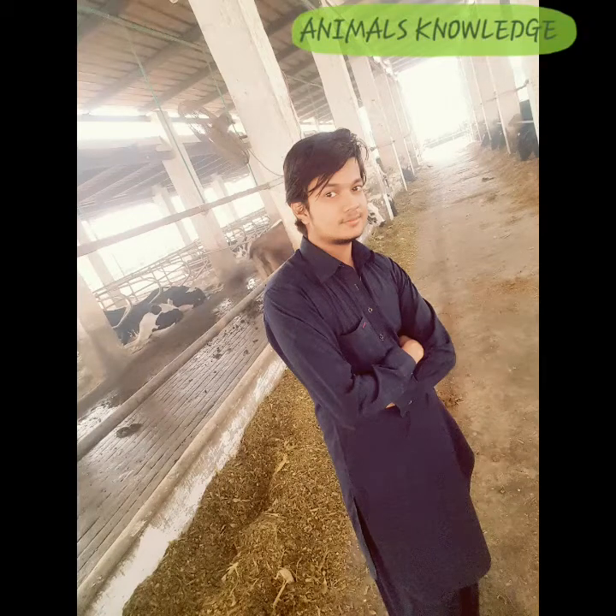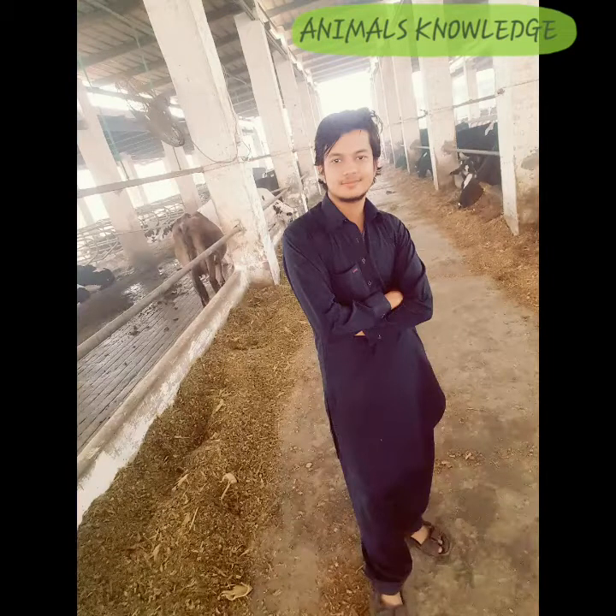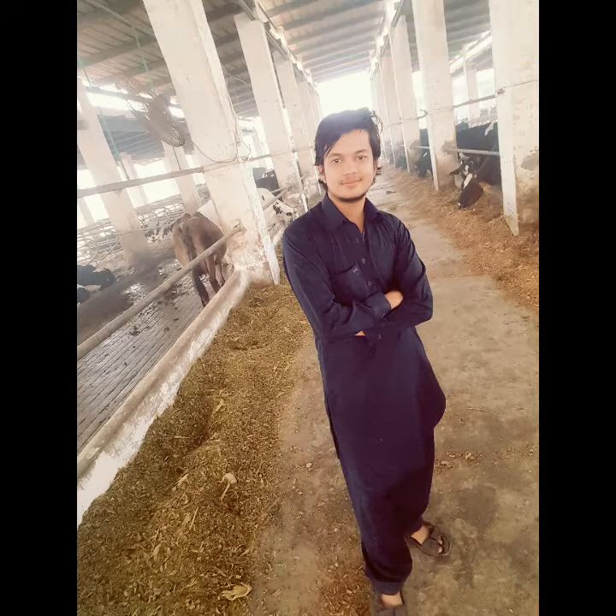Assalamu alaikum. I'm Dr. Mursa Khalil from Animals Knowledge. Today I show you how to fix the left abomasum displacement by roll and toggle.